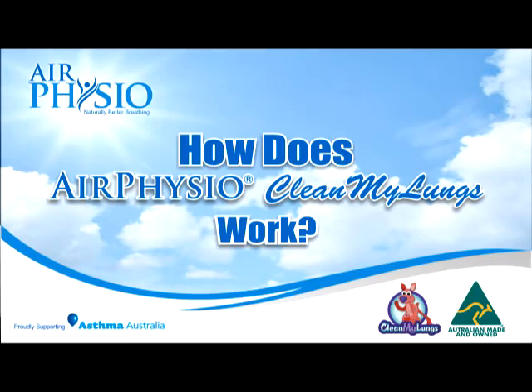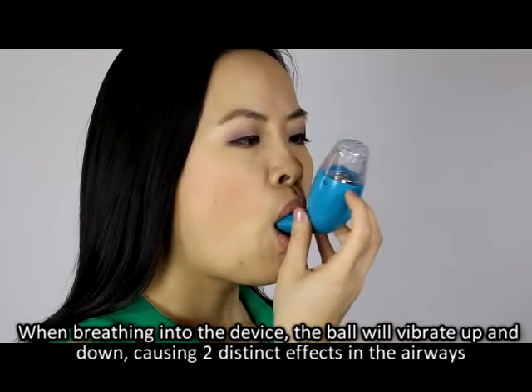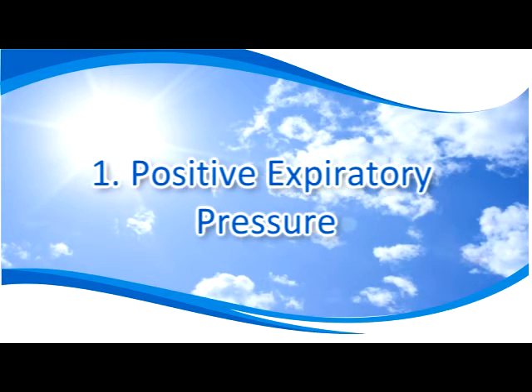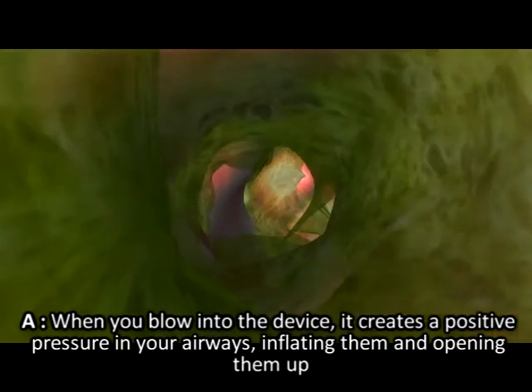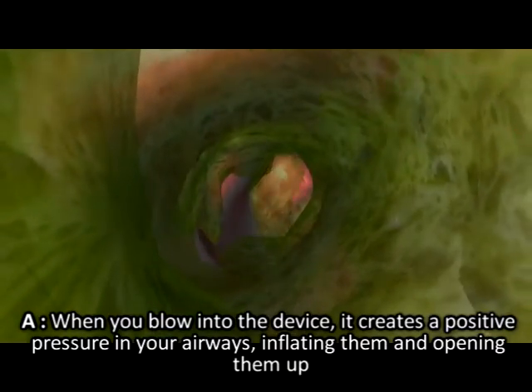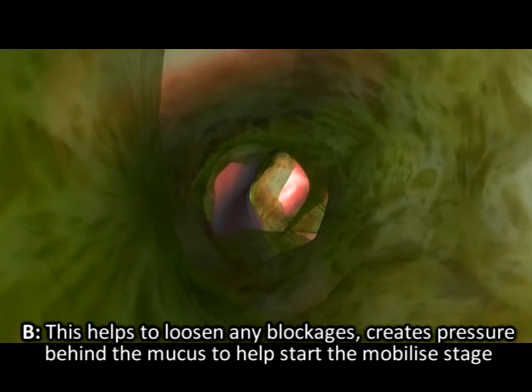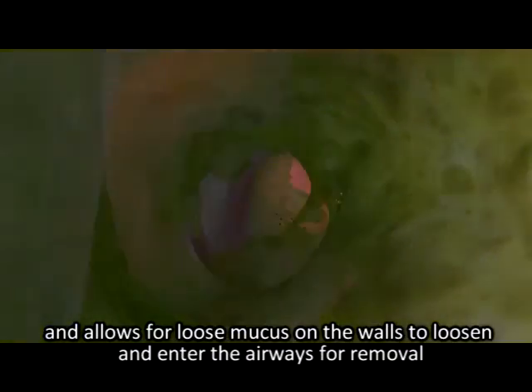Step five: repeat the elimination sequences of stages one and two until your lungs feel clear or you breathe easier and deeply. How does Air Physio Clean My Lungs work? When breathing into the device, the ball will vibrate up and down causing two distinct effects in the airways. One: positive expiratory pressure — when you blow into the device it creates a positive pressure in your airways, inflating them and opening them up. This helps to loosen any blockages, creates pressure behind the mucus to help start the mobilization stage.